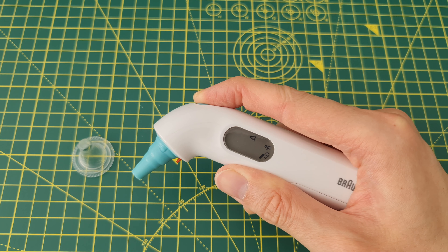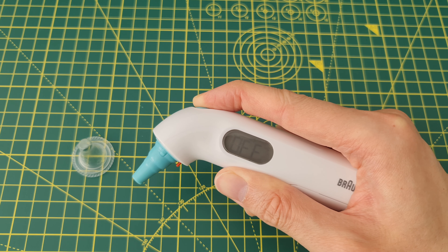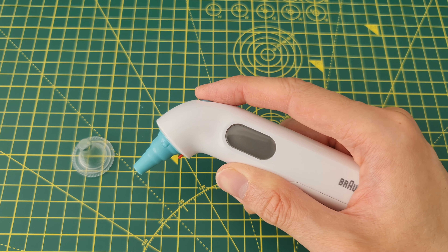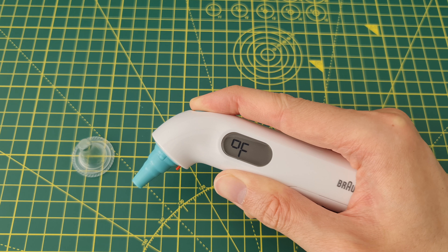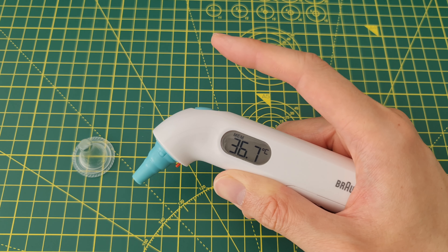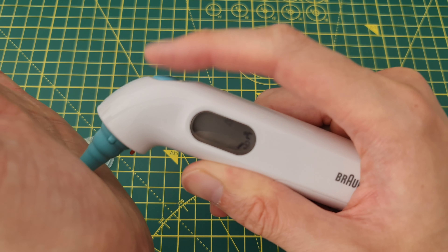Once more — turn the power off, I'm going to set it back to Celsius. Hold the button, let it cycle — Fahrenheit, Celsius — let go and then it's set to Celsius.